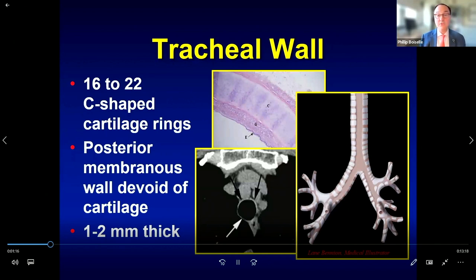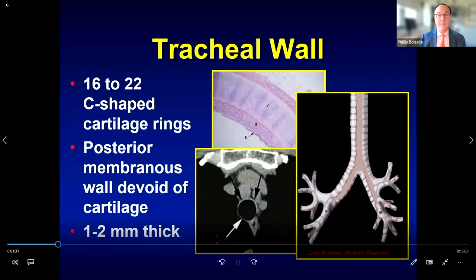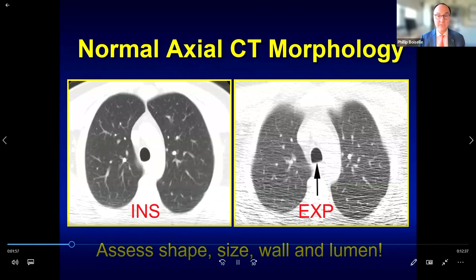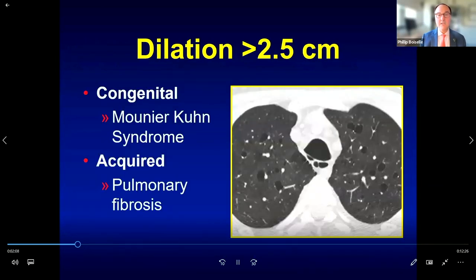The anterior and lateral walls of the trachea are composed of 16 to 22 C-shaped cartilage rings, which are relatively inflexible. In contrast, the posterior membranous wall is more flexible. On paired inspiratory and end-expiratory CT scans, the oval shape typical at inspiration changes at expiration — the posterior membranous wall moves forward, creating a flattened posterior wall and an overall horseshoe shape. In some patients there may be actual anterior bowing of the posterior membranous wall.